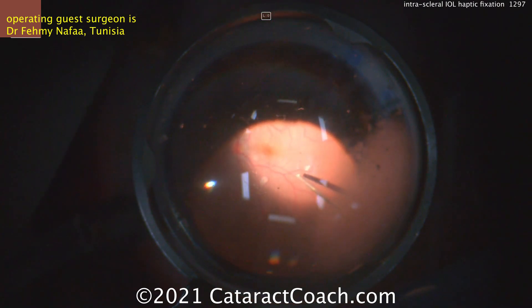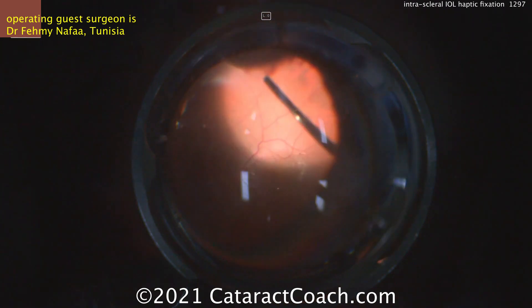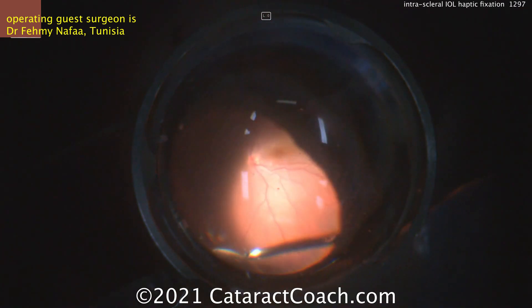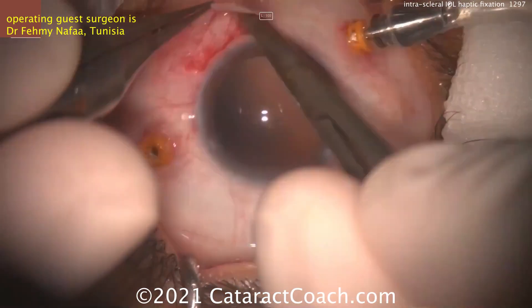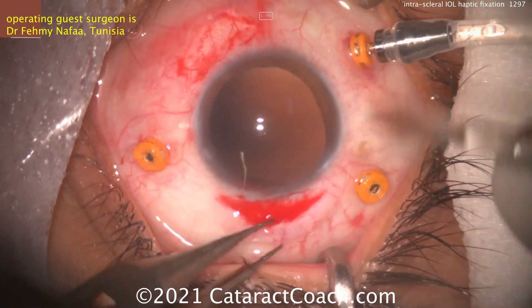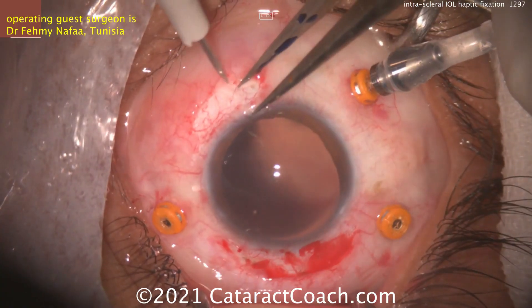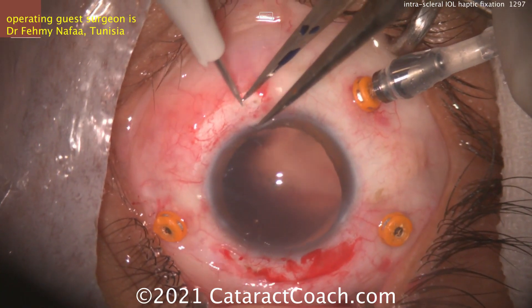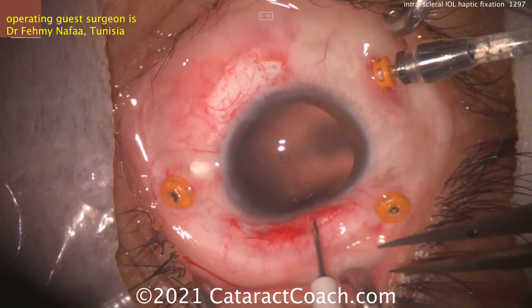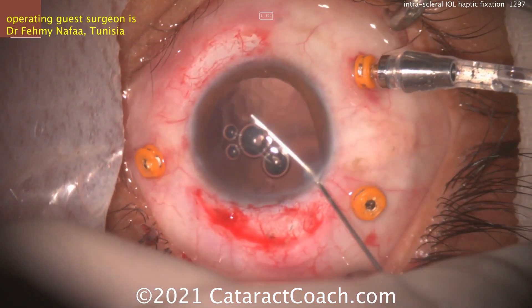Dr. Agarwal described this many years ago, and there are many patients who have many years of very strong support, even way down the line. Another advantage of doing the full pars plana vitrectomy is that the IOL optic and the haptics end up moving a lot and get into the mid-vitreous. If you didn't clean up all that vitreous ahead of time, you may end up causing vitreous traction, chronic CME, or maybe even a retinal break. Here he's making another entrance — 180 degrees apart — where the haptics are going to come out.